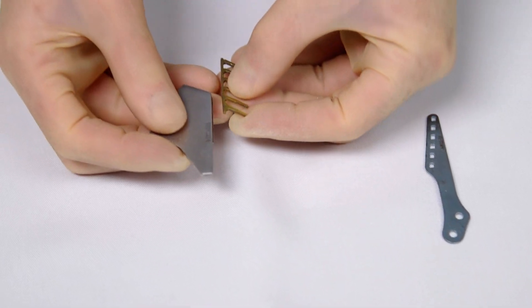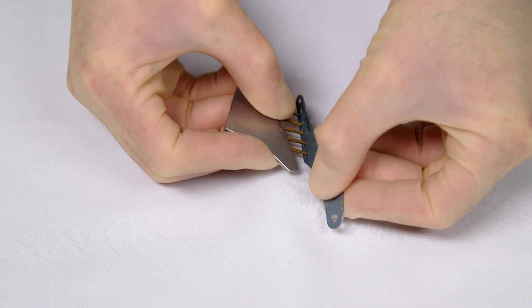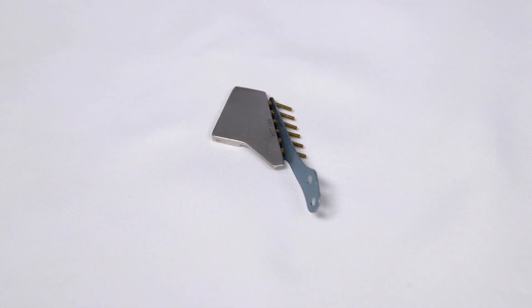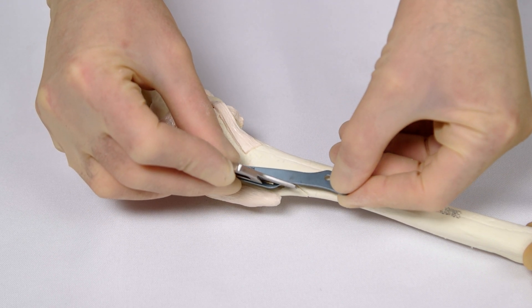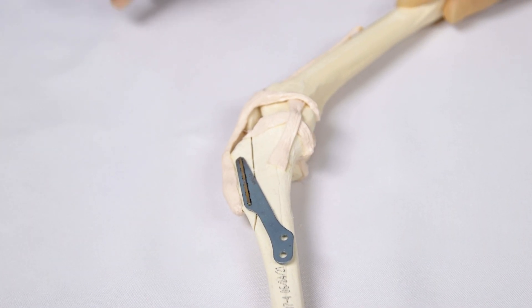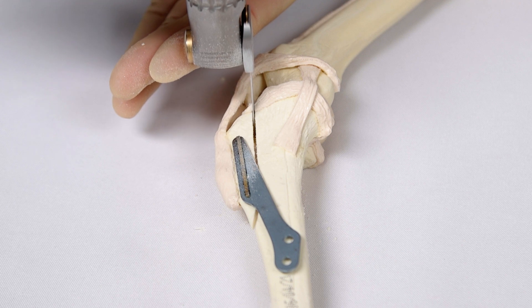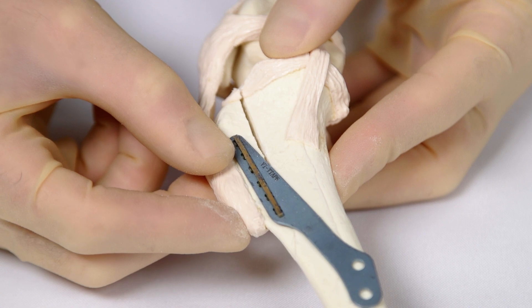The back of the fork is inserted into the fork holder and the prongs of the fork inserted through the holes of the plate. The prongs of the fork are then manually inserted into the pre-drilled holes in the tibial tuberosity and then tapped home using a mallet against the fork holder or directly against the back of the fork. Once the plate and fork are placed securely, the osteotomy can be completed proximally by making the previous cut bicortical. The tibial tuberosity will now be free and unstable.